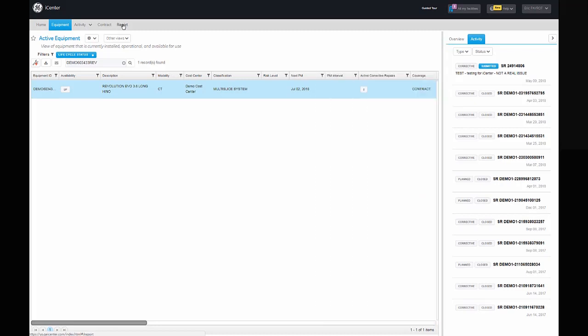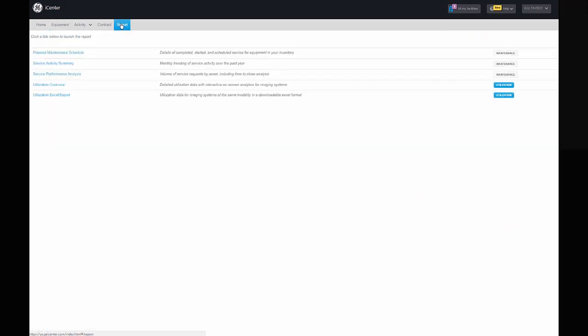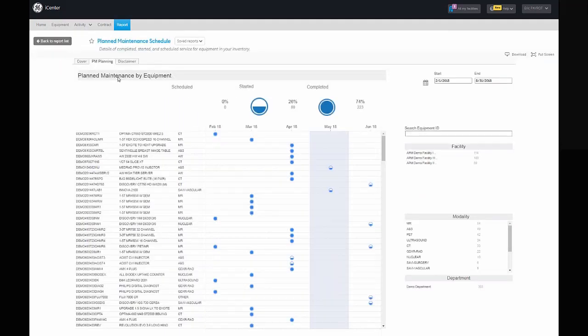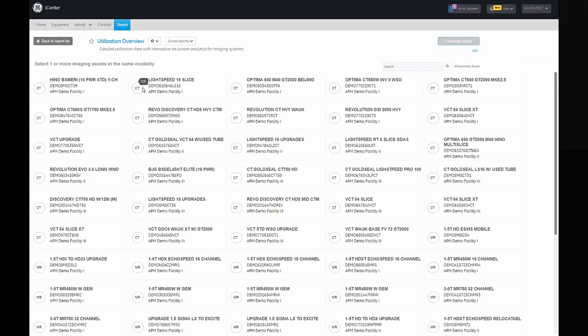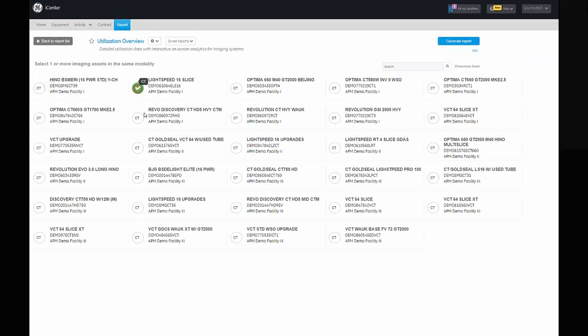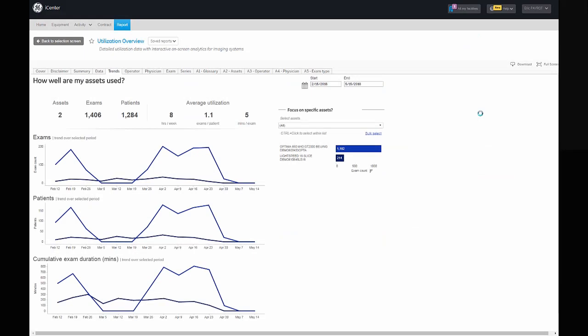The Report menu allows you to launch summary reports about maintenance and service activity, as well as utilization reports for connected imaging equipment. These reports provide trends and analytics that help you optimize usage of your assets.